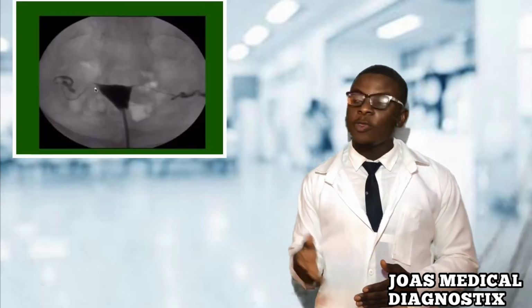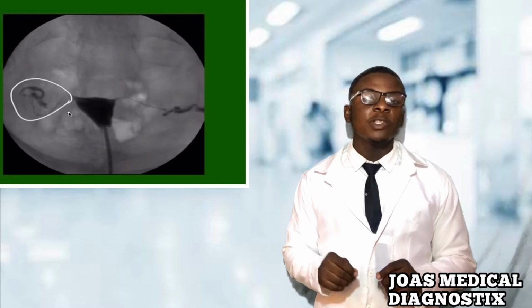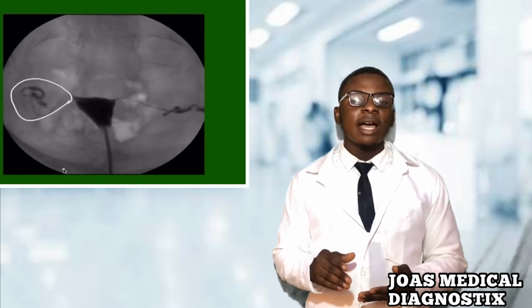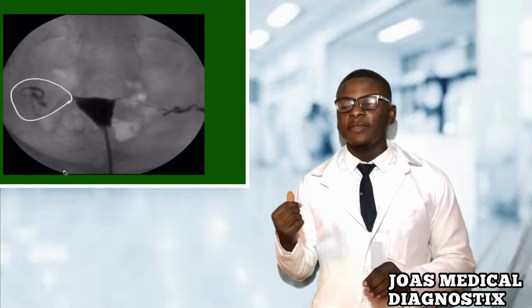Next, we see the uterus. This uterus has a normal shape and contour. Finally, we are going to look at the fallopian tubes. Fallopian tubes have three parts. You can see the skinny portion, that's the part that's closest to the uterus. The fallopian tube then gets wider in diameter. That's the ampulla and the very end of the fallopian tube. This is the fimbria, which is a little bit difficult to see in the films.